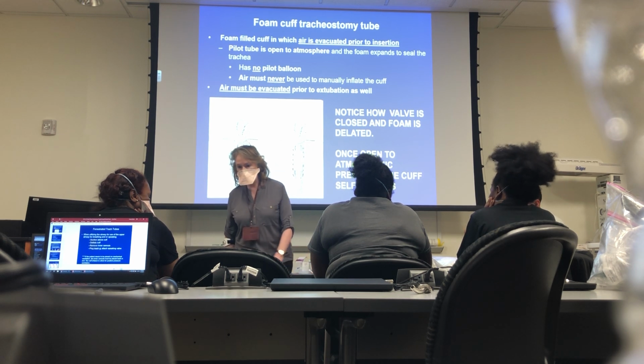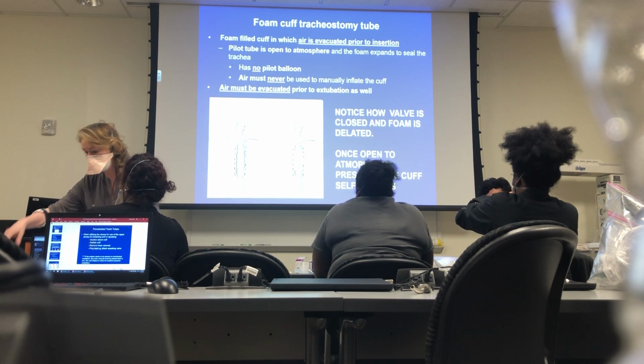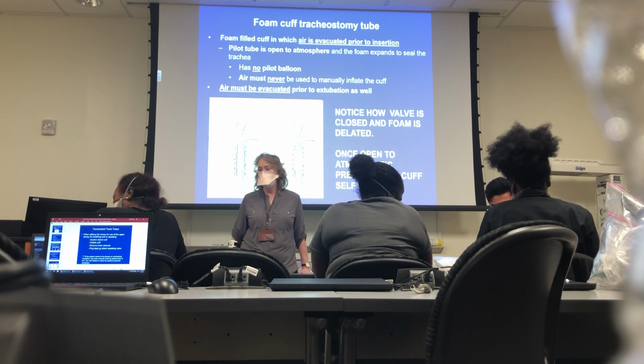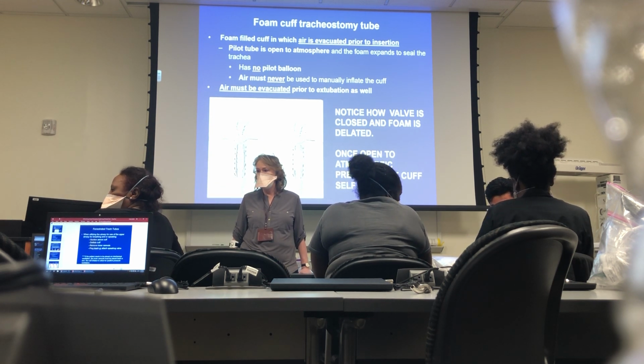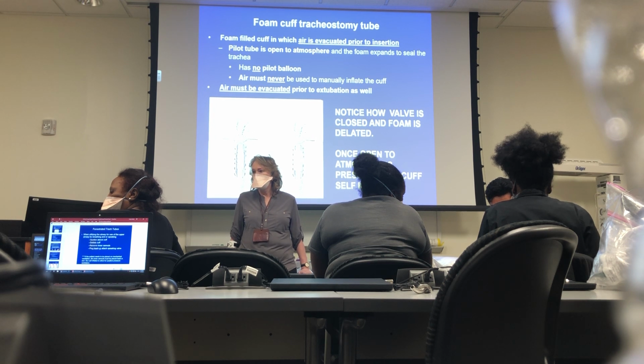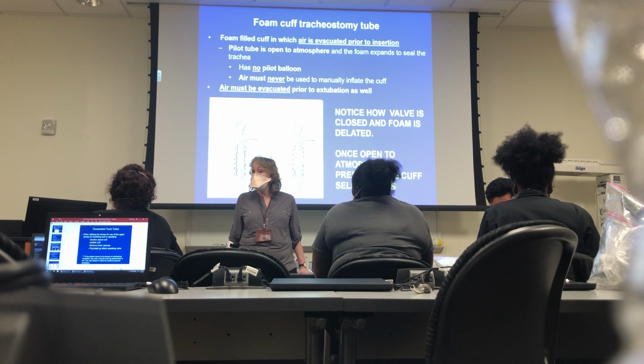Here, you guys try it here. Because until you do it, you don't know what you're doing. Whoever wants to do it. So you want to get that totally down. So you have to keep it squeezed. There you go. Now open it to room air.